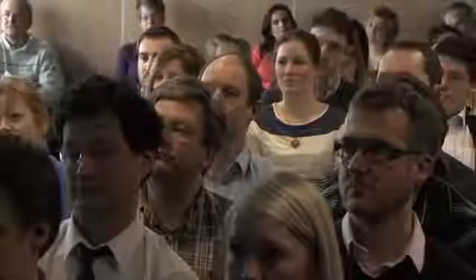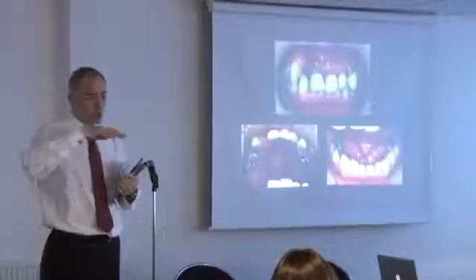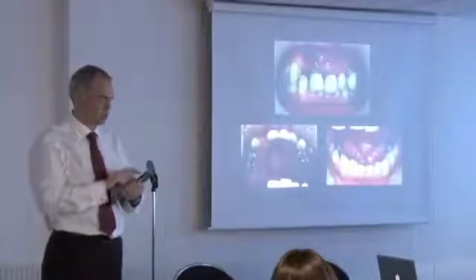And as I said before, not all cases can be treated with implants. If I was treating this with implants, I'd take all the teeth out and I'd move all the bone up. It used to be a heinous thing to do, consider losing bone. But here we'd actually start taking all the bone away in order to move the bone beyond the lip line. So again, make something that looks aesthetic. But I don't have to do that with a denture.